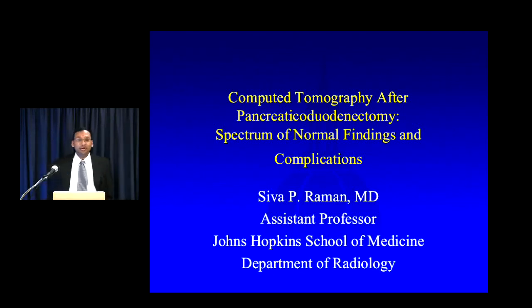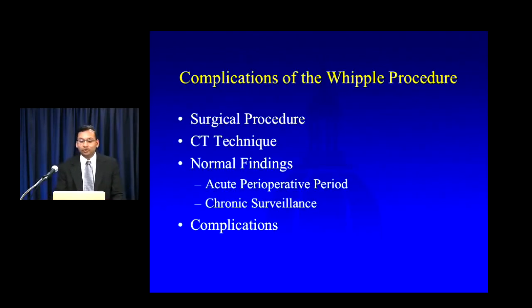Hi, this is Shivaraman. I'm from Johns Hopkins University in the Department of Radiology, and we're going to talk a little bit about computed tomography after pancreaticoduodenectomy. We'll talk about normal findings and some complications that you should be looking out for.